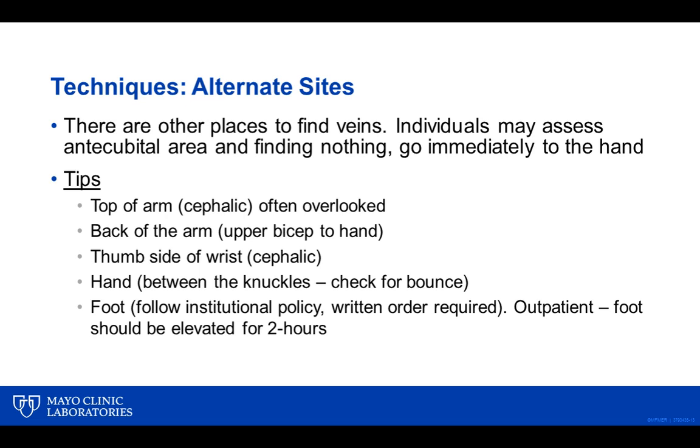Between the knuckles, a lot of times I've actually drawn blood from fingers and thumbs, and placed IVs in fingers and thumbs. They don't last very long, the IVs don't, but a lot of times you just got to take your time. Sometimes it takes 2 techs to make that work. But you use what you got.